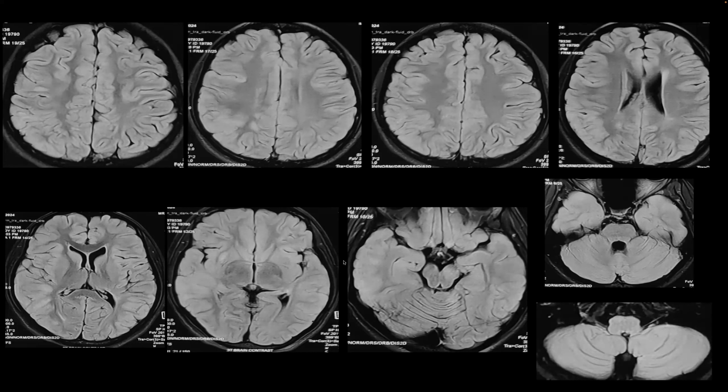I'm not sure if there is some signal abnormality in the temporal lobe out here. In comparison to the left, you can see it is slightly more hyperintense. And the midbrain on the left is showing these hyperintense foci. So cerebellum, I cannot again appreciate based on the quality of the scan, but I think it looks normal. So there are multiple subcortical cortical hyperintensities in the frontal, parietal, temporal lobes, and also brainstem involvement, and periventricular white matter and deep white matter involvement.